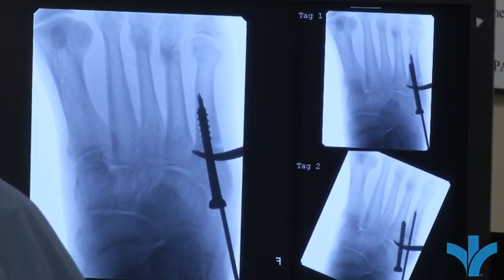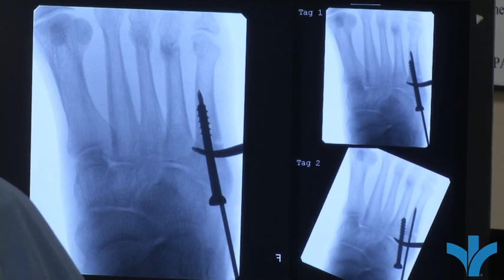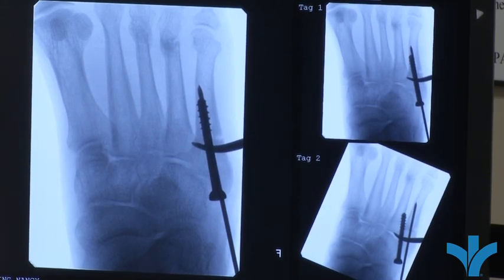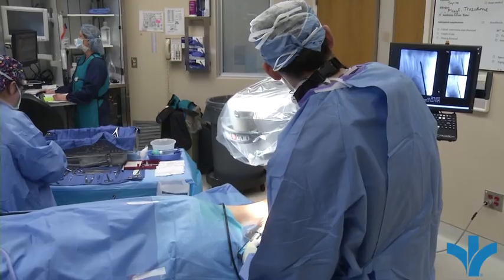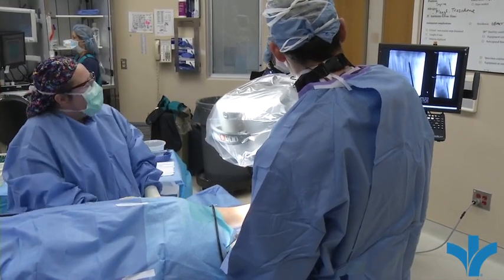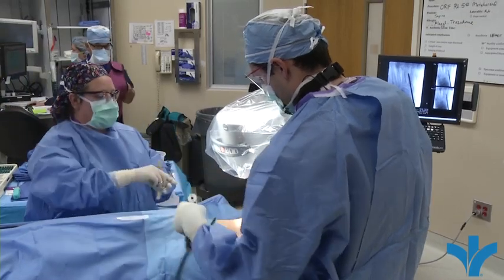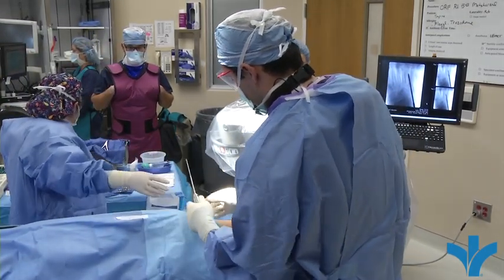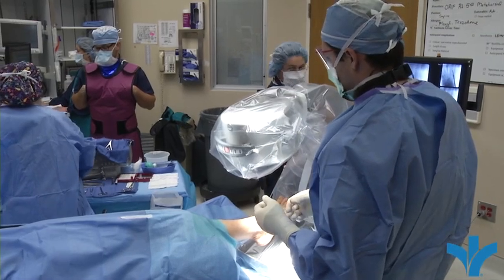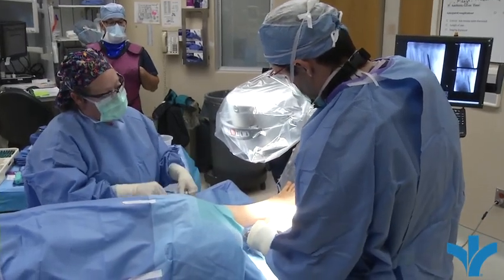We're trying to get the threads of the screw just past where the fracture is — that's all we want — just to compress that bone together in the correct spot. We'll ream this under x-ray to make sure we stay right in the middle of the bone. Reaming does two things: it creates a path for the screw to go into, and it drills the bone, which stimulates healing that hasn't occurred in that area. The bone is sclerotic — hardened — where it's been trying to heal up, so there's often resistance as you go through the fracture site.